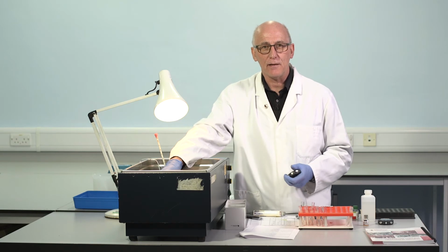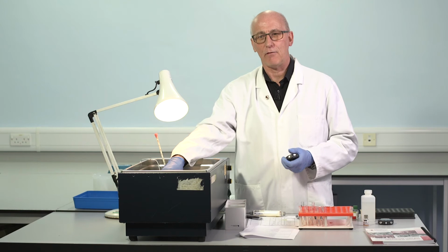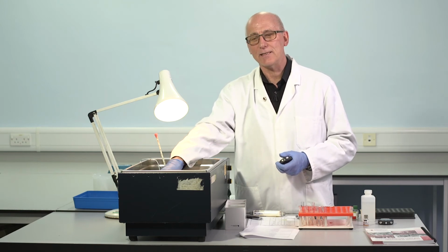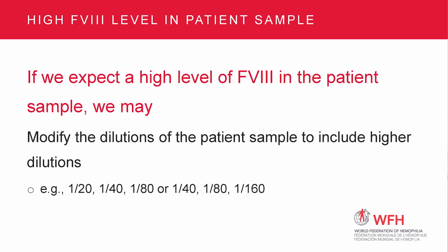Perhaps we've got an APTT that's particularly short. If we do still want to make an accurate factor VIII concentration assay in such a patient, we can also take that into account when we construct our patient dilutions. So if we anticipate a rather high level, or perhaps we've done the factor VIII assay that indicates a high level, if we need an accurate answer, and we may do, then we should make higher dilutions.